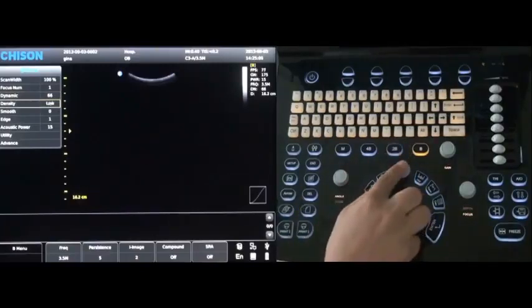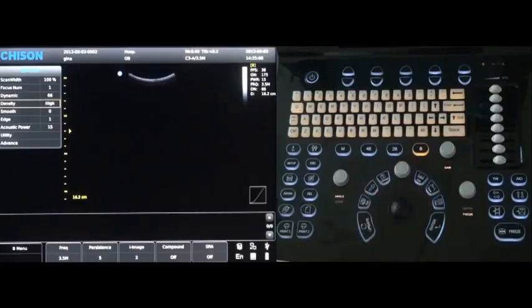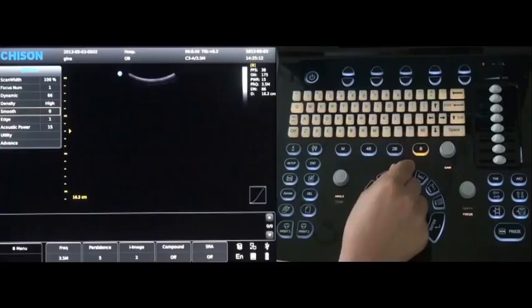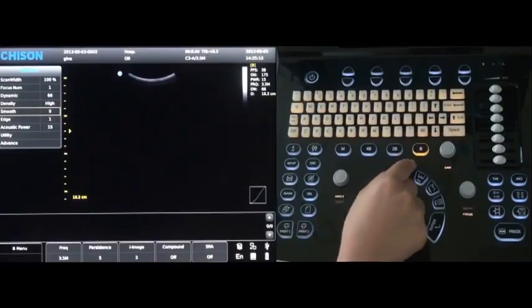Density high or low, we suggest you to choose high. Go to smooth, you can choose different smooth levels.